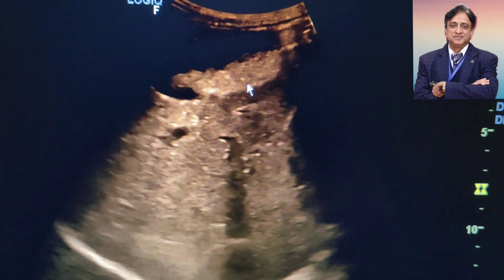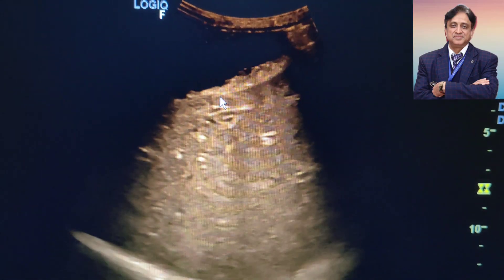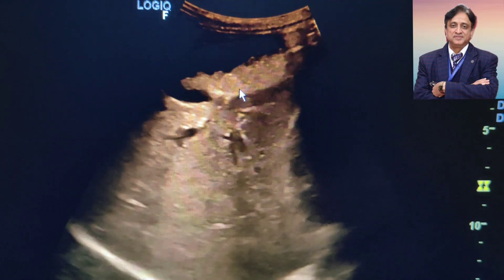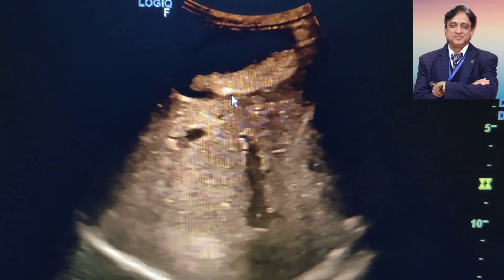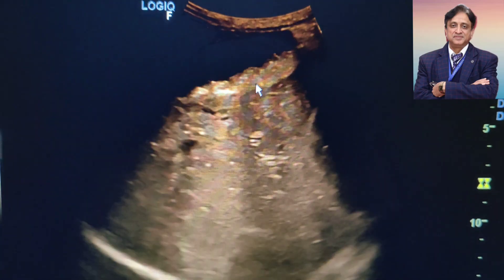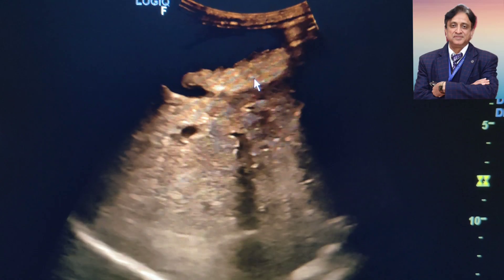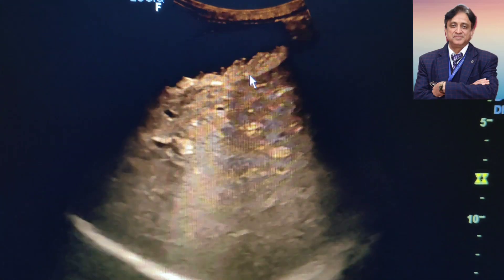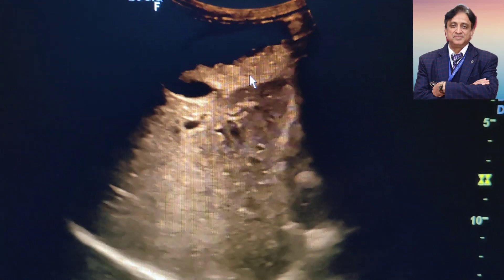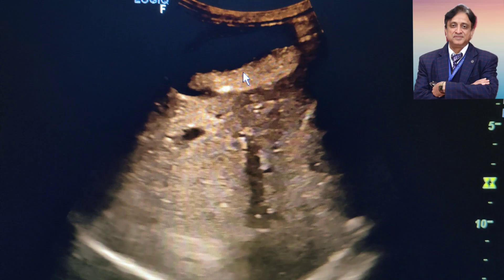Sludge is generally associated with small stones in the gall bladder, and these stones may cause shadowing. You can see that these could be very very small particles, which may be gallstones, and they must be hidden inside the sludge.